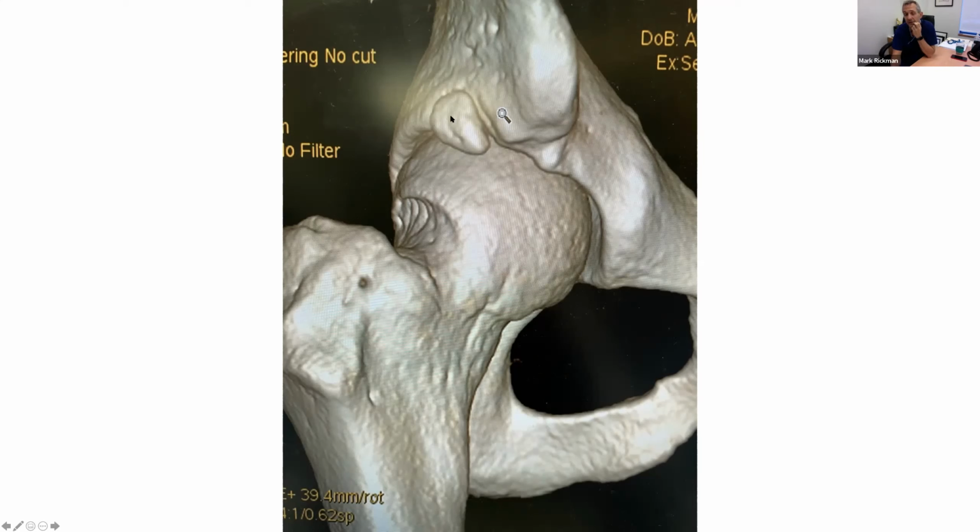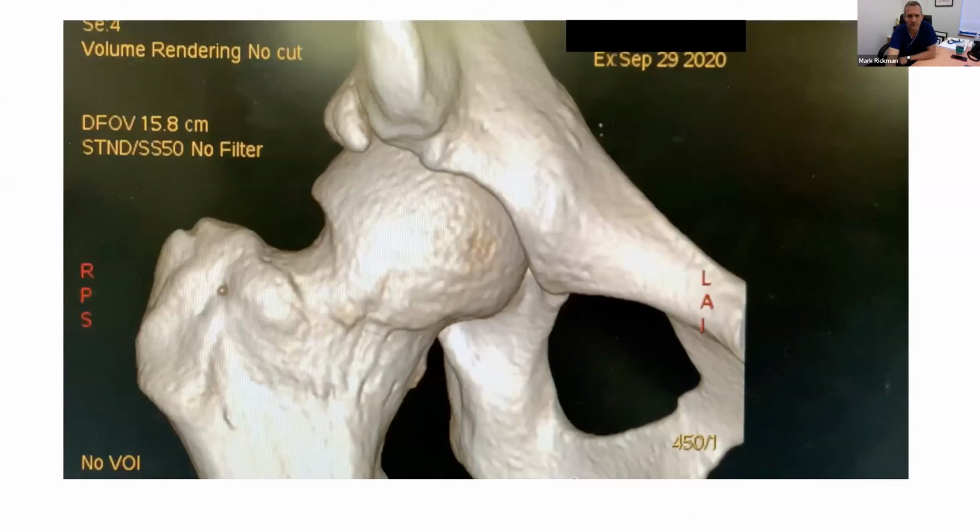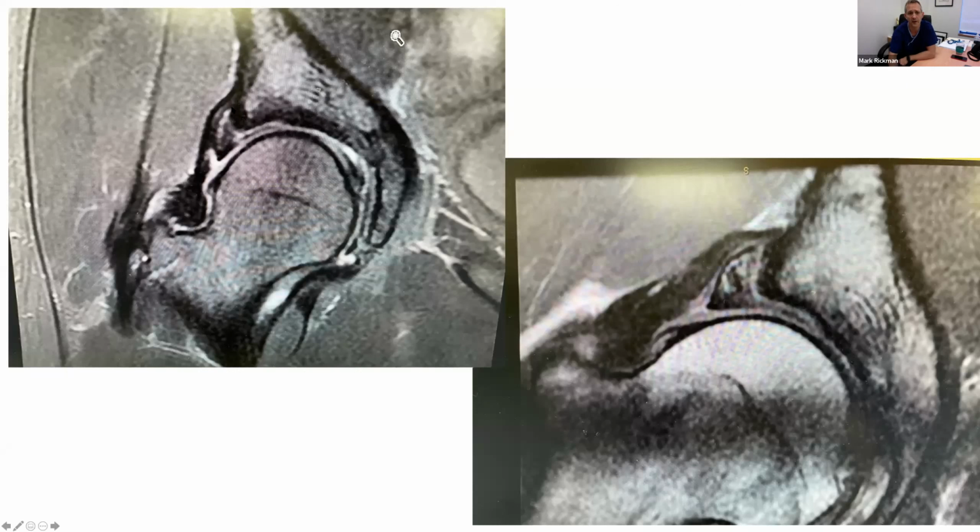I think sometimes these are small and they're there from birth and it's a developmental thing. There's also a theory that some of them represent little fractures, a fracture of the edge of the acetabulum. And there are definitely cases where you get a CT scan and you can see that there's a clear line. Now here, let me just go past that. On his MR, the os is here, the labrum's there. And here, that to me, I don't think that's a fracture from that. But you see somewhere it sits here and there's a clear fracture and a clear big piece of bone.